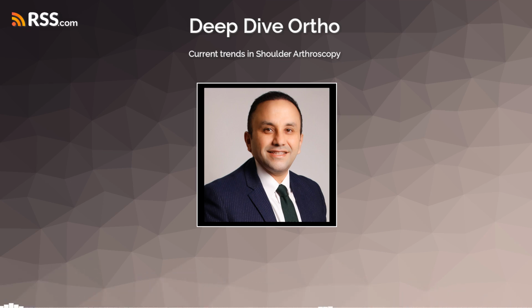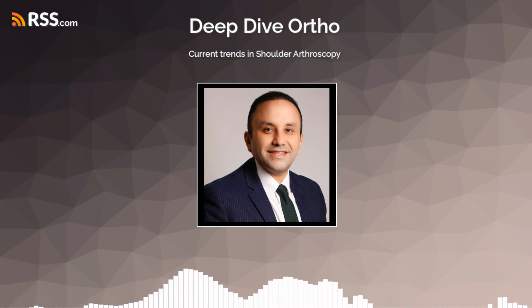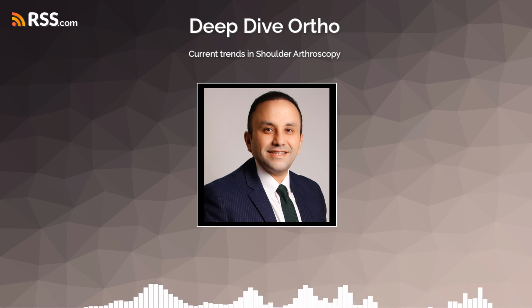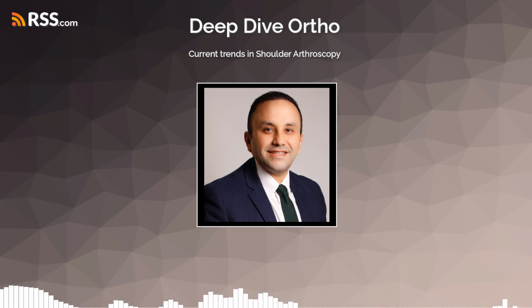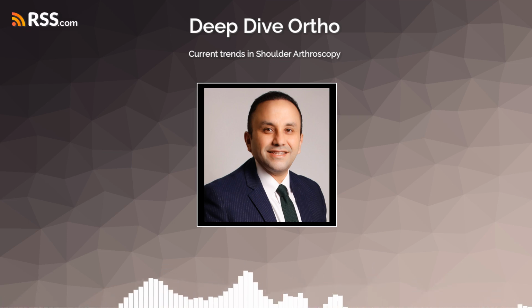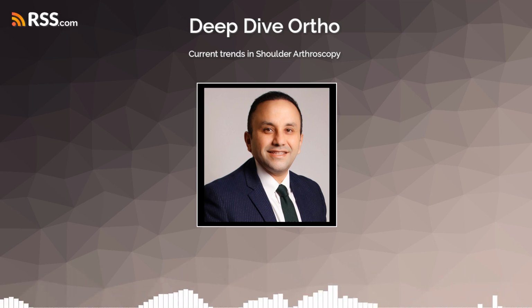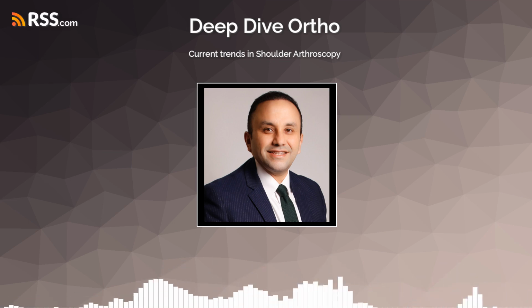When wouldn't you use that? Well, this technique is generally not recommended for patients who have very loose joints overall, what we call global hyperlaxity, or if they have significant bone loss on the humeral head itself, or if they've had a previous resection of the end of the clavicle. Okay. What happens when a Latarjet procedure, unfortunately, doesn't achieve the desired stability? Is revision possible? Revision surgery after a failed Latarjet procedure can be quite complex, as you can imagine. Surgeons sometimes use a specific posterior portal, an entry point at the back of the shoulder called the Halifax portal. A specific portal? Yeah, this portal can provide better access and visualization of the surgical area during these tricky revision procedures, allowing for a more thorough assessment and repair.